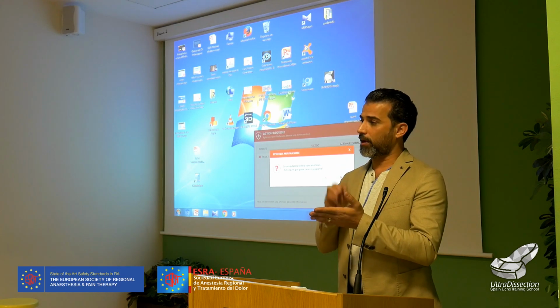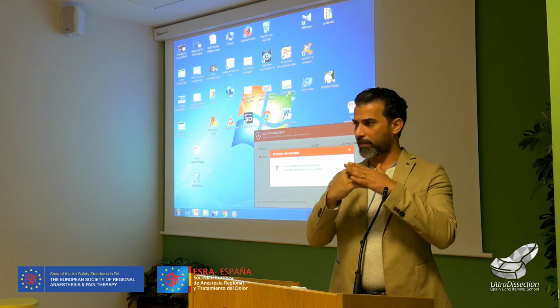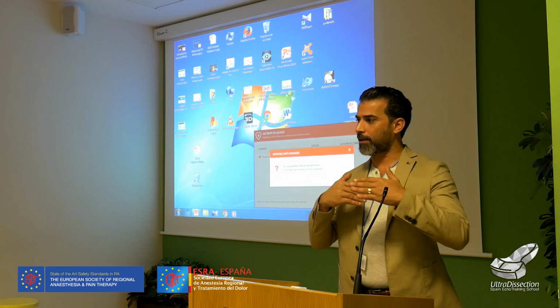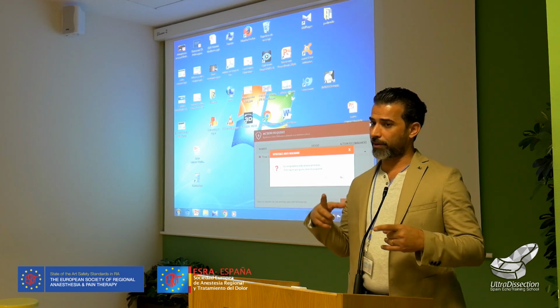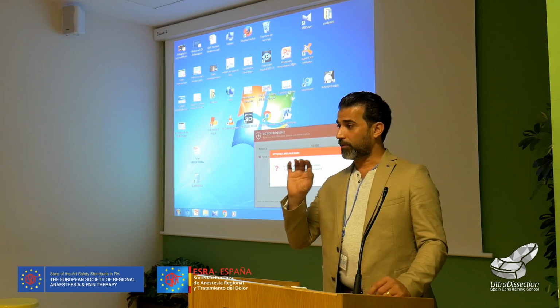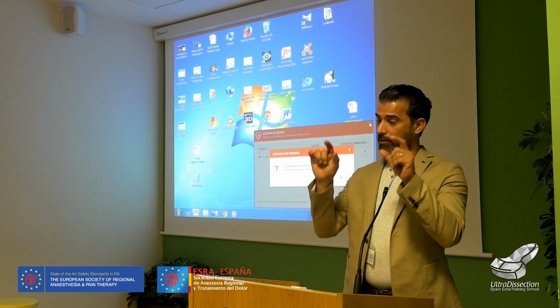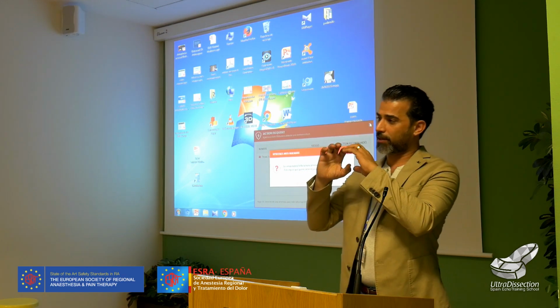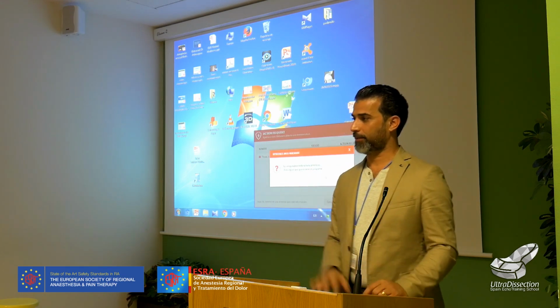Okay, you here see not a well-defined epineurium, but here you should identify the epimysial layer from the epineural layer. This is the tip. The epimysial layer, which is the muscular layer, adheres to the nerve normally, or at the fascial penetrating point where the nerve penetrates the fascia and goes to the target muscles or skin, whatever. So here, do not identify the epineurium because it's disrupted. Go to the surrounding structures, to the muscles or fascia, and then go through the fascia. How to dissect the fascia? The nerve will be more clear, and then more clear. Then go layer by layer. So this is the answer.